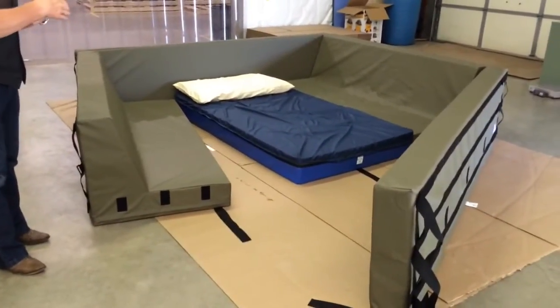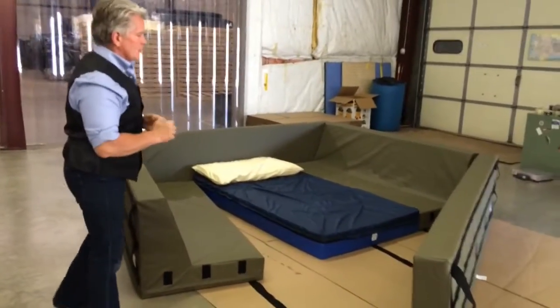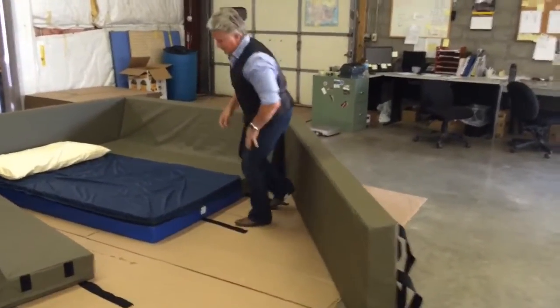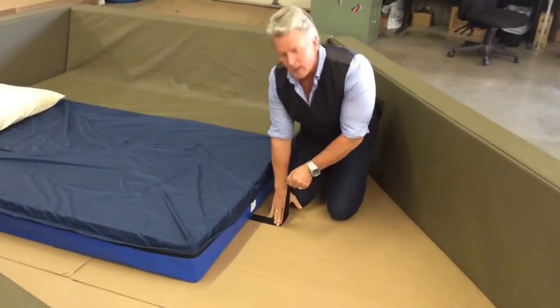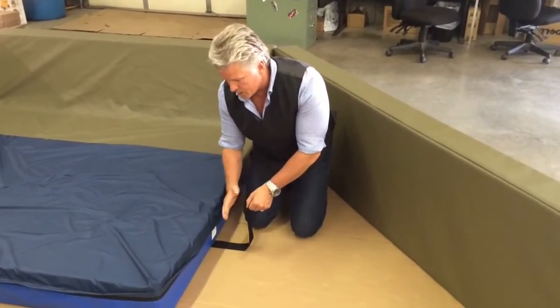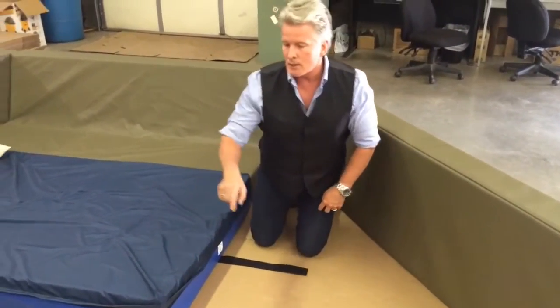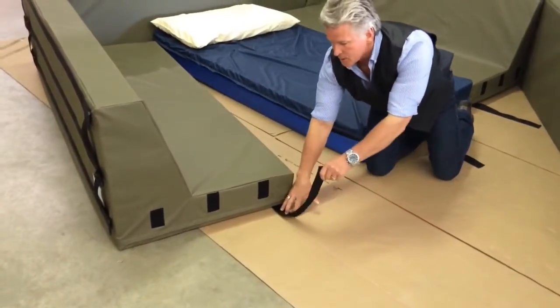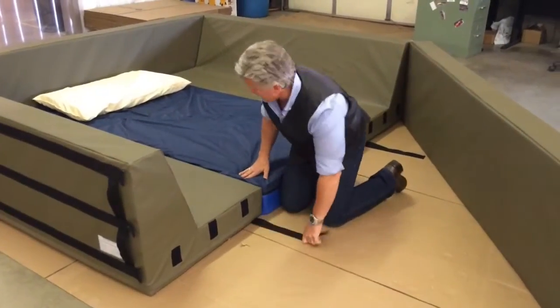And that's the way, and the mattress is just held in place by the cinching of all the cushions around it. We did put a strap that comes off of the mattress itself, and that passes then underneath the footboard and secures the footboard to the mattress, so that if they push against it, it doesn't want to leave the edge of the mattress. And each of the side bolster cushions have that on it as well, to secure the headboard and footboard to the mattress assembly.